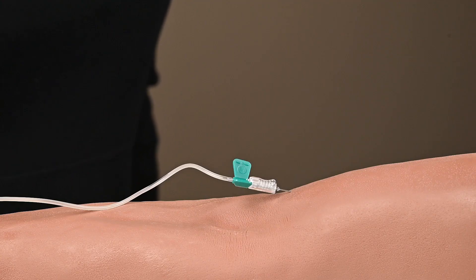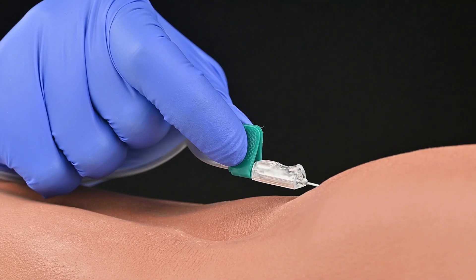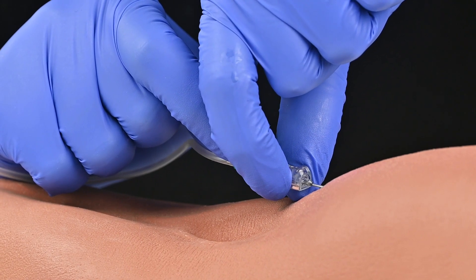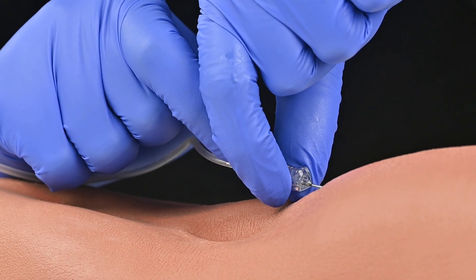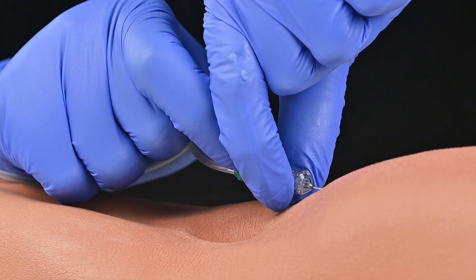You will hold the wings with your dominant hand using your thumb and index finger. Your non-dominant hand will grasp the sides of the telescoping shield. You will use your thumb and index finger to anchor the shield while staying behind the needle and maintaining control over the needle.